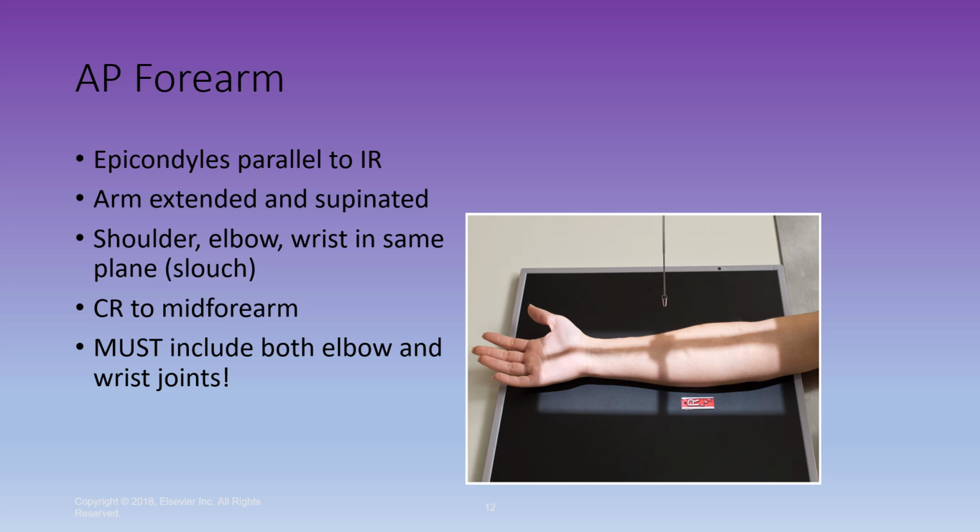So the marker would go lateral to the part as it's hung. So I would argue that this marker should be on the other side, because when this hangs, it hangs fingers up. Okay, so far everything we've talked about, fingers, hand, thumb, wrist, and now forearm, all of these images hang fingers up when you're looking at them.